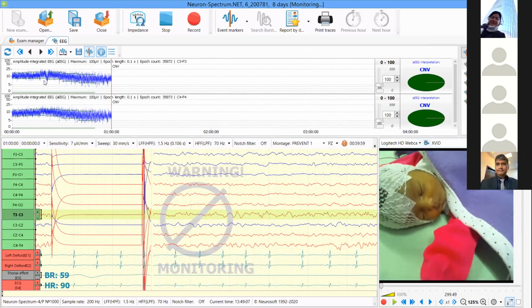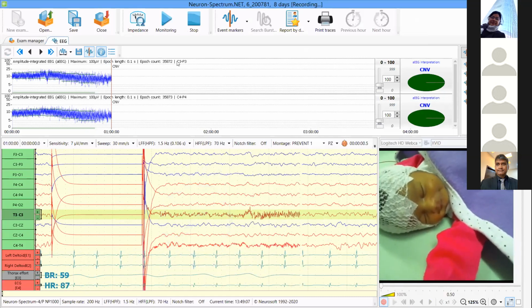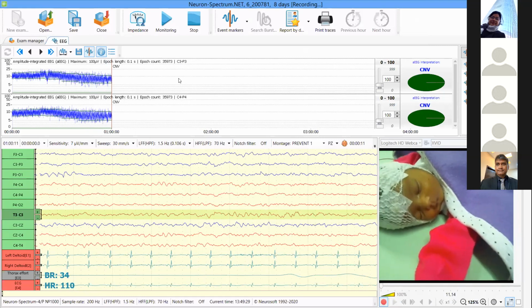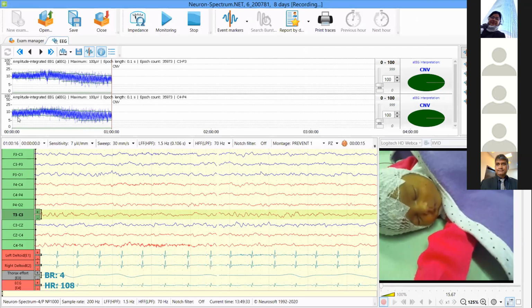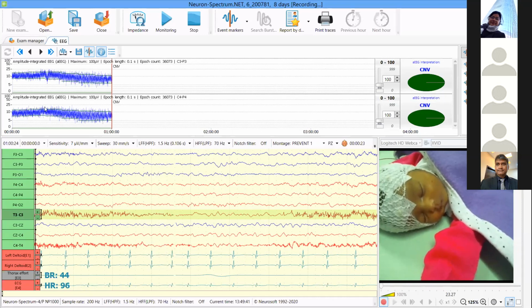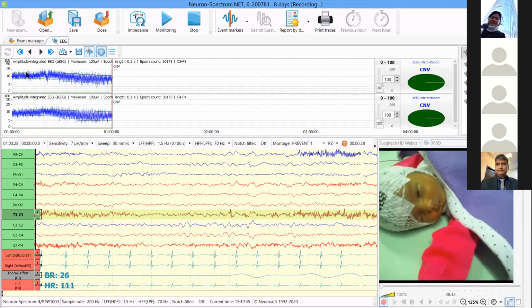When you see the screen here in the top frame, there is the Amplitude Integrated EEG, which has already been discussed. We are using mainly 4 leads. For the left side, we have C3-P3, and for the right side, we have C4-P4. So with 2 channels, we have Amplitude Integrated EEG. And in this Amplitude Integrated EEG, we can see that the lower margin is above 5, and the upper margin is around 10, not really above 10. And it is symmetrical.